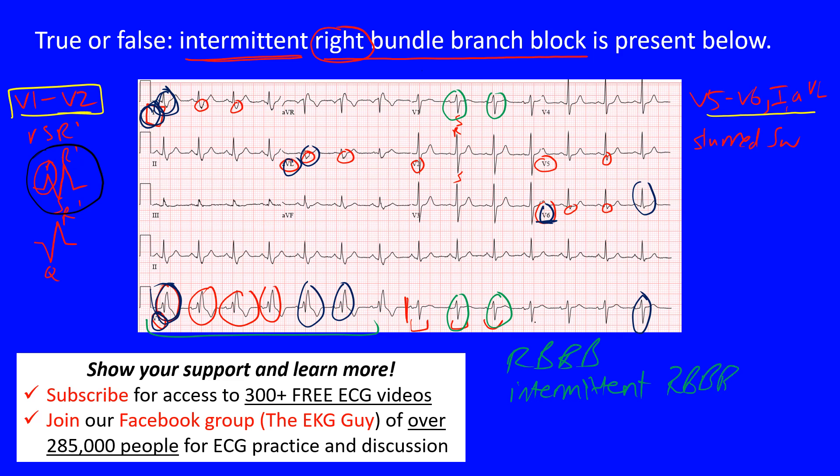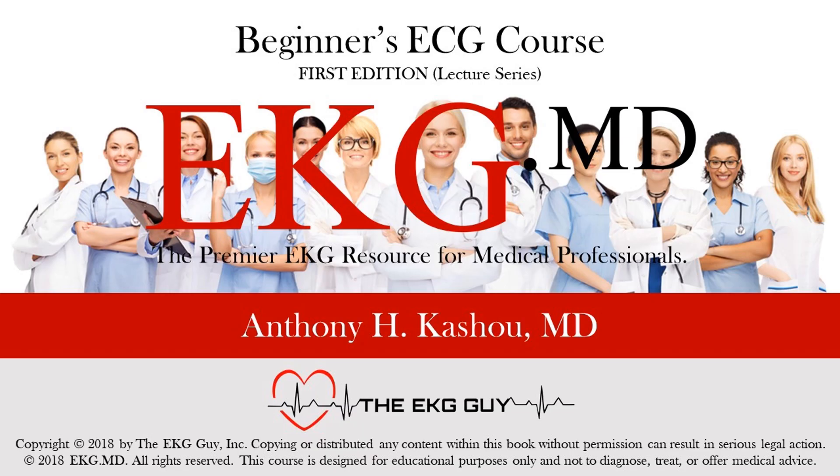You don't always catch intermittent right bundle branch block, but when you do it's quite fascinating - and on this ECG we certainly did. So this true or false question asking if intermittent right bundle branch block is present - the answer is certainly true. The key is to know the basics and make sure you factor in the entire ECG.